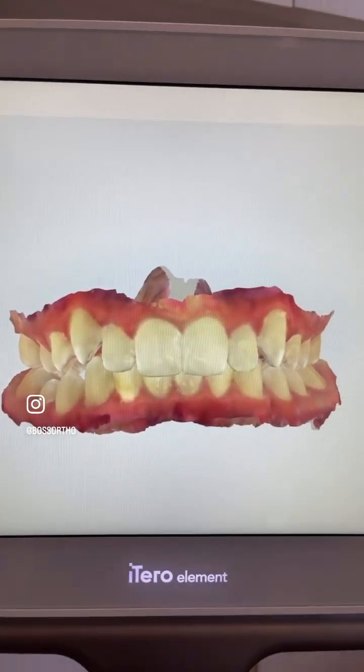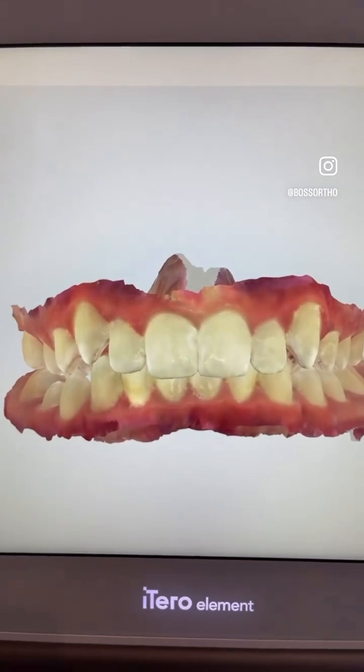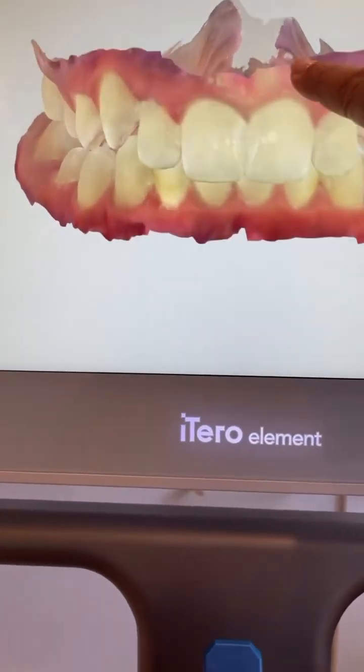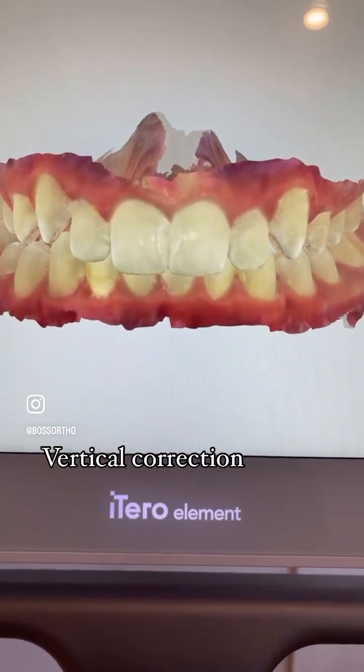Looking at this child now, I can see the leveling of gingival height straight away. That strikes me. I can see the transverse is pretty good. So we've established the transverse is good. Let's look at vertical. I can see a bit of leveling of the gingival heights as required.